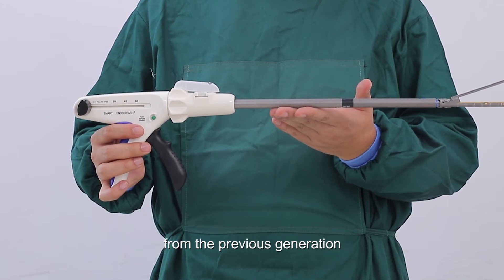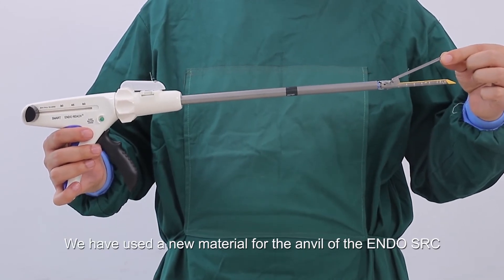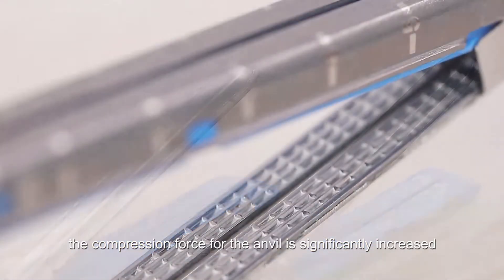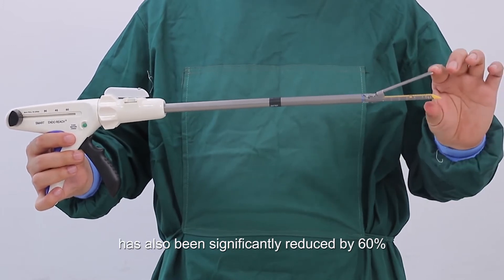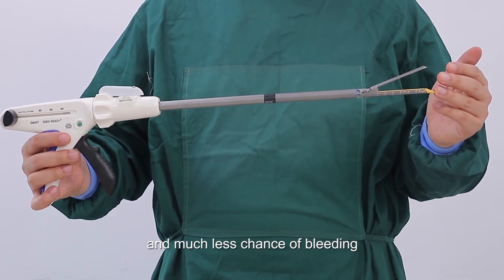We have kept all the excellent designs from the previous generation, but we have also added new features to improve the device's clinical performance. First, the material of the anvil. We used a 400 series medical grade steel for the anvil of the EndoSRC. The compression force is significantly increased, clamping force is increased, therefore any milking effect is significantly reduced by at least 30%. The percentage of staple malformation has also been significantly reduced by 60%, resulting in better staple line formation and much less chance of bleeding.